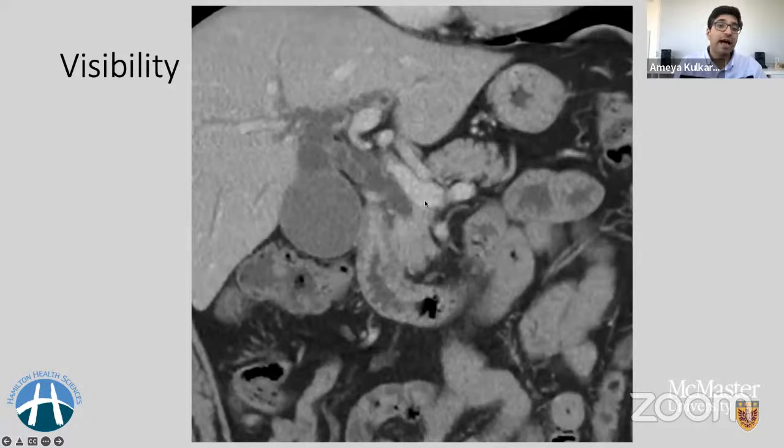And the most important thing we have to do as a radiologist in this case is to assess if there is any disease which will render this patient unfit for surgery. Because even if you don't see the macroscopic tumor on imaging, you can definitely exclude tumor extension along major vessels in the upper abdomen or metastatic foci. And that should be your goal in this particular case.